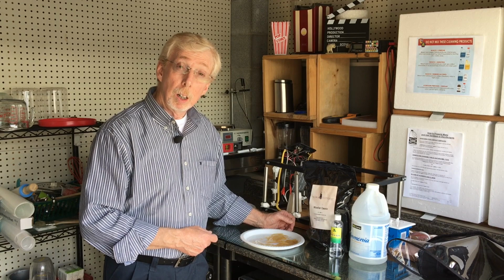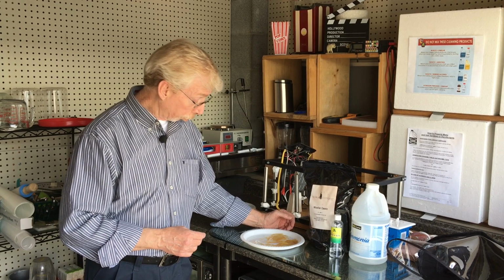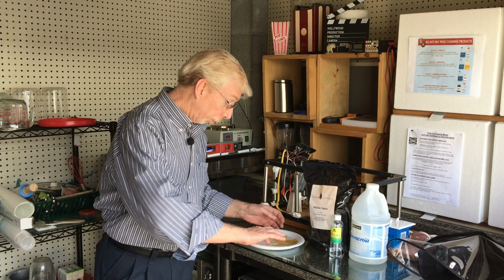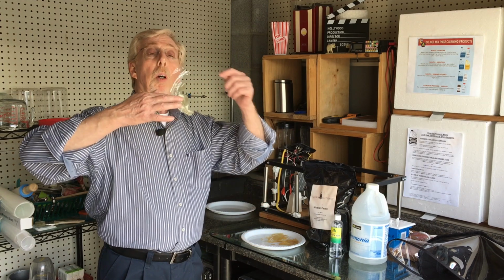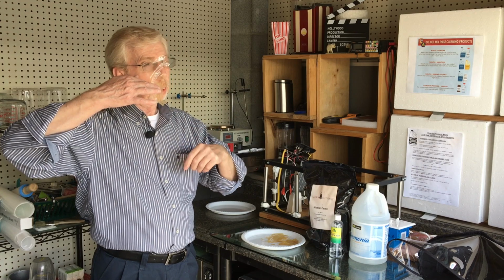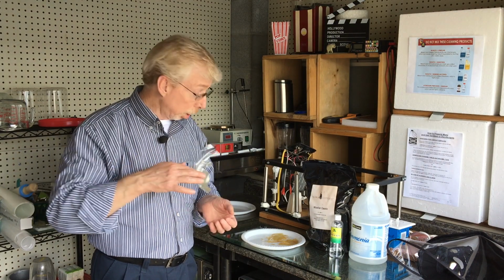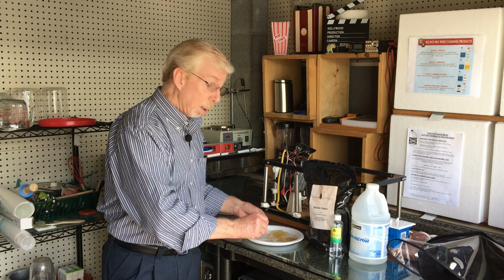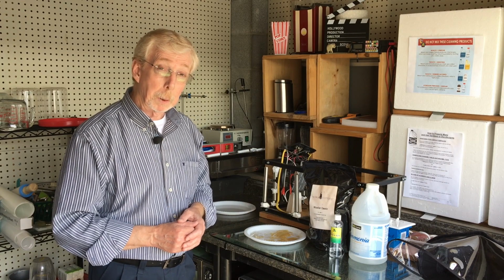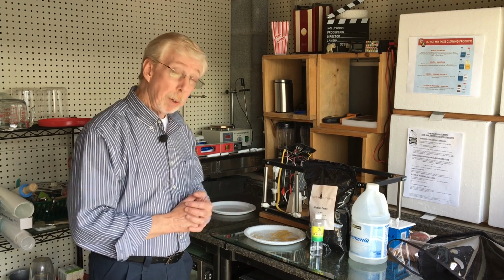And what we have are good results, however, mixed results. Let me explain that. Where it dried clear, it's very clear, near optically clear. However, where it dried thick, you can see the amber color against the white fairly well. And it's still brittle, even though I added some glycerin. So the glycerin has to go up in the next batch. I'm going to remake this.